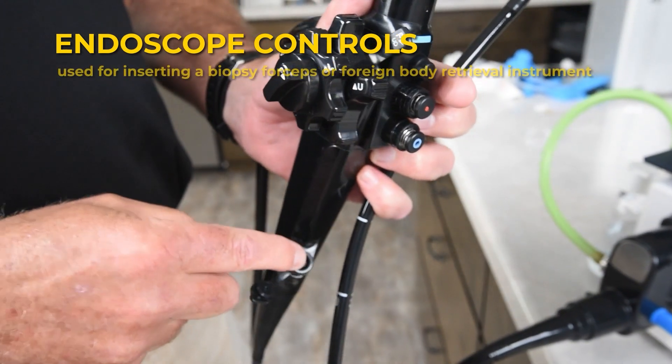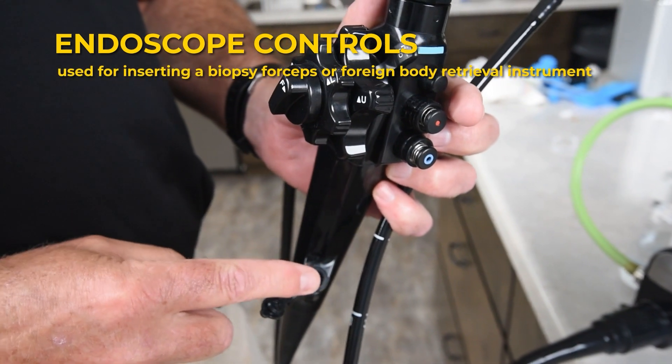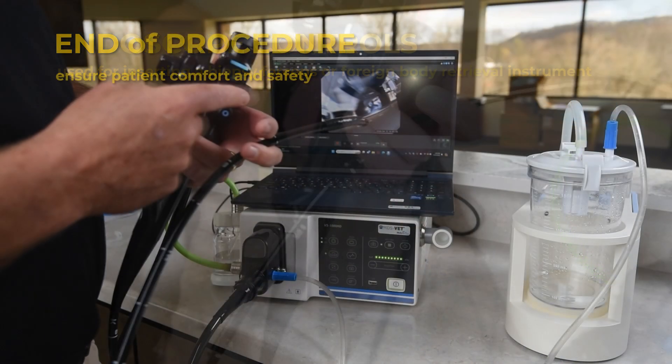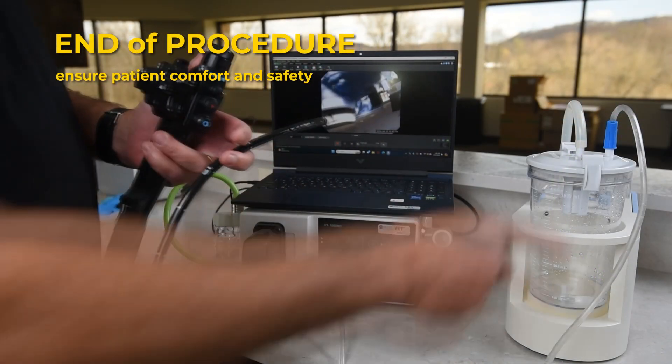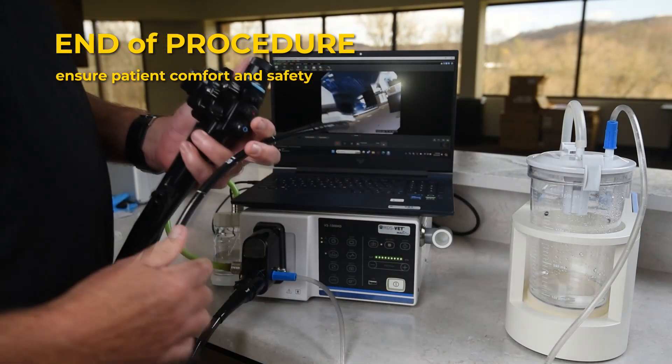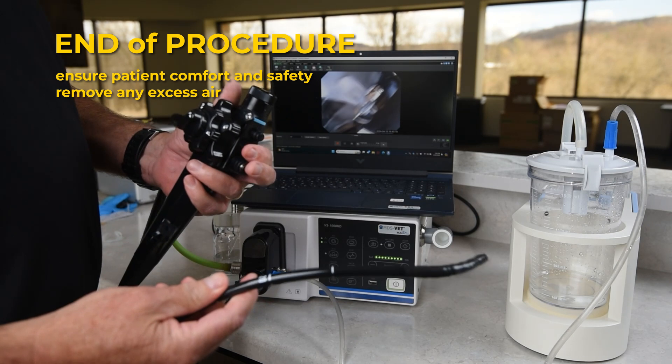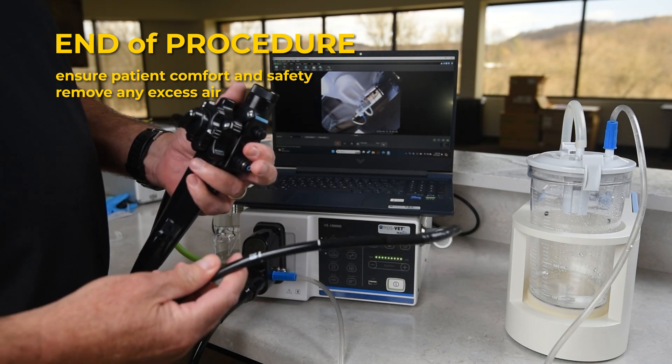The biopsy port is used for inserting a biopsy forceps or foreign body retrieval instrument. During normal operation, room air is being drawn through the blue button. At the end of the procedure, remove any excess air by activating the suction unit by pushing the red button.